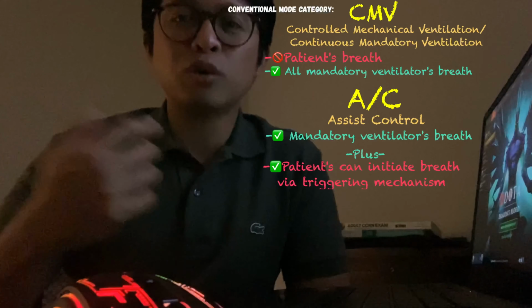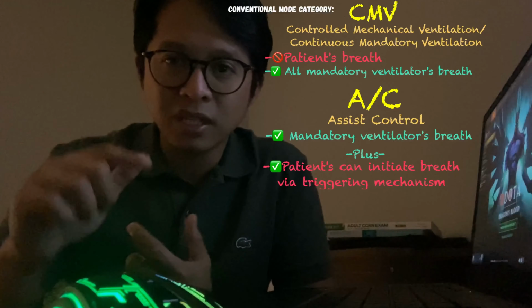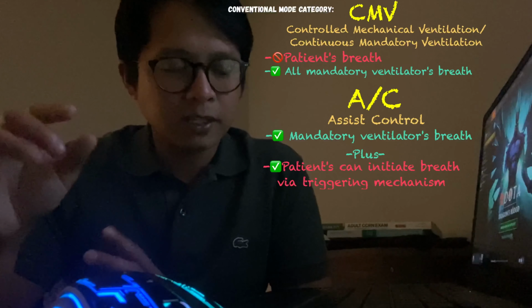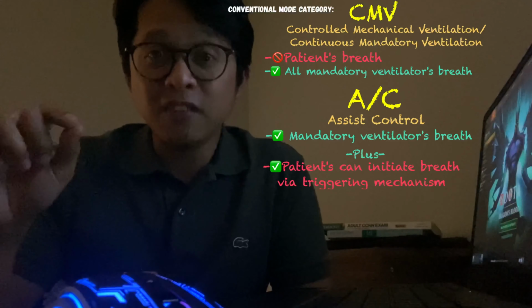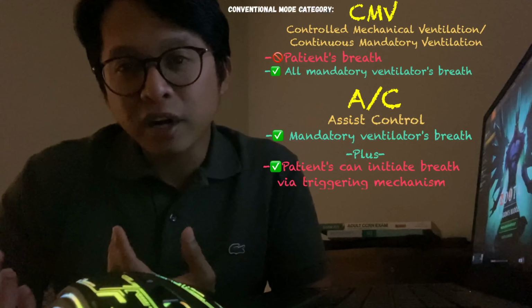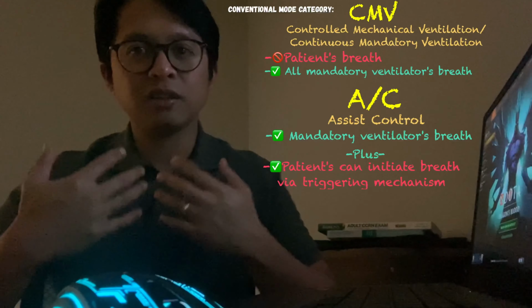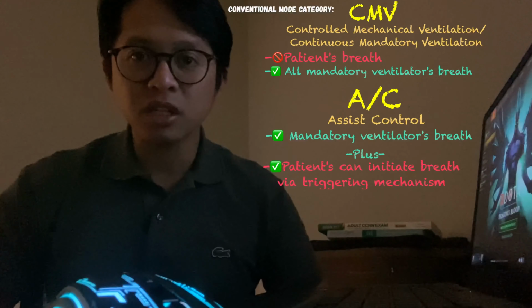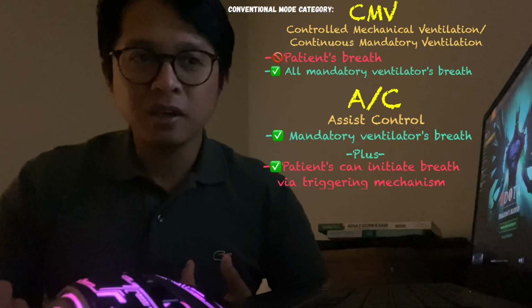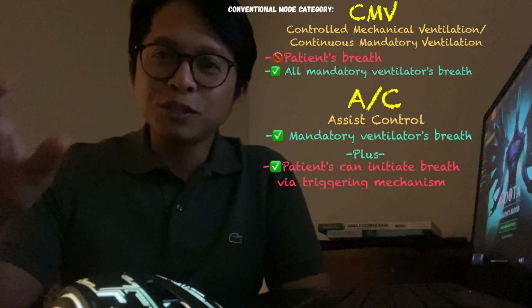In an assist control mode, the patient is allowed to initiate a breath between these 6 seconds. For instance, the ventilator gives a breath now. Then the ventilator will wait for another 6 seconds to give the next breath. But if the ventilator senses that the patient wants to breathe through the trigger mechanism, then the machine will say, "Oh, you want to breathe, huh?